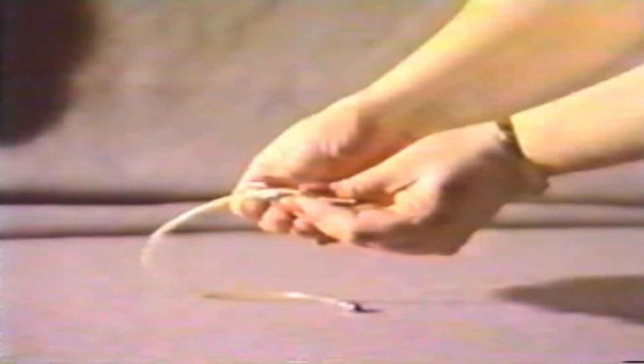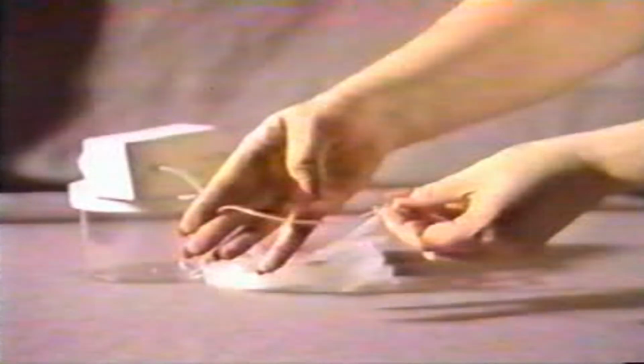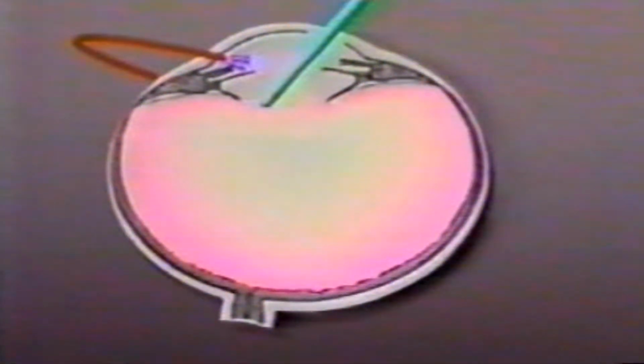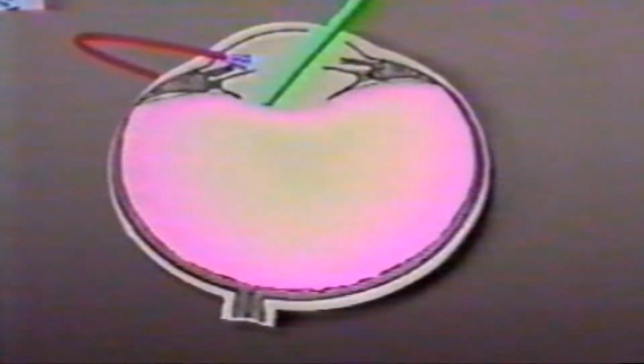In the presence of a posterior capsule tear, the tear gets tamponaded by the anterior chamber maintainer, and there is no hydration or very minimal hydration of the vitreous, thus allowing us to do the anterior vitrectomy or remove the vitreous from the pupillary area and the anterior chamber very effectively.